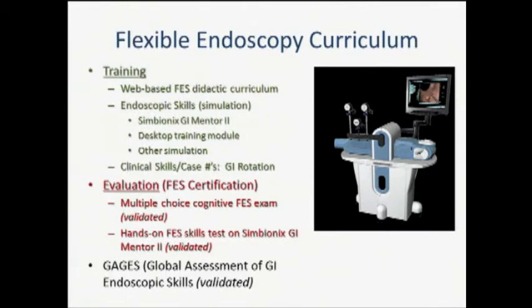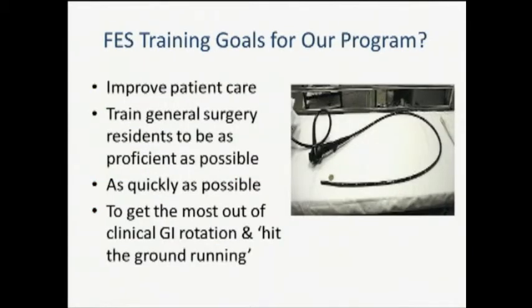In terms of formal evaluation and FES certification, there's the multiple choice cognitive FES exam, which I think Dr. Vasilio is going to talk to you about, and the hands-on FES skills test on the GI Mentor. Both of these have been validated. And then there's the GAGES, or the Global Assessment of GI Endoscopic Skills, which is also an assessment, but is separate from the FES formal exam. And I'm going to show you how we plan to incorporate all of these.